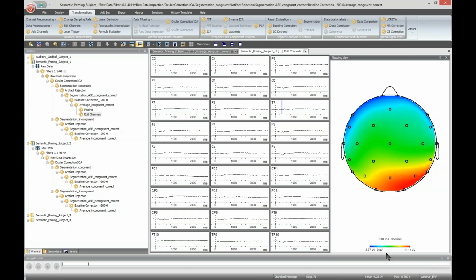Okay, let me see on the time. I still think I do one more question, definitely. There is actually a nice one here. It was mentioned earlier that you could also have reaction time differences. I guess that was in the semantic priming. And I have a similar experiment, and I'm thinking to do that as well. Can I investigate that in Analyzer, or do I have to do that elsewhere?